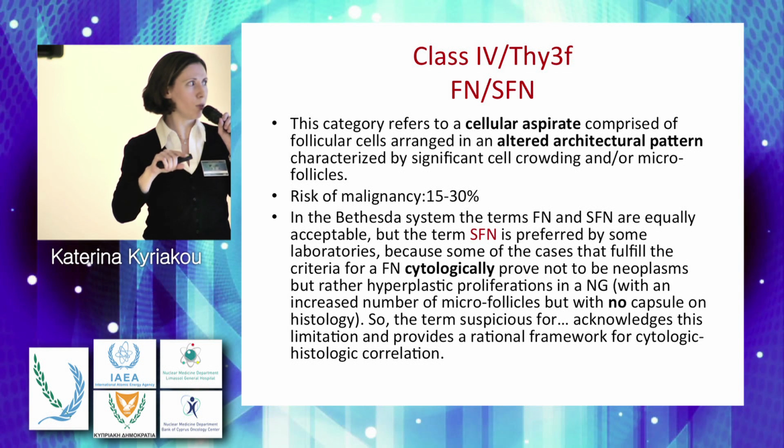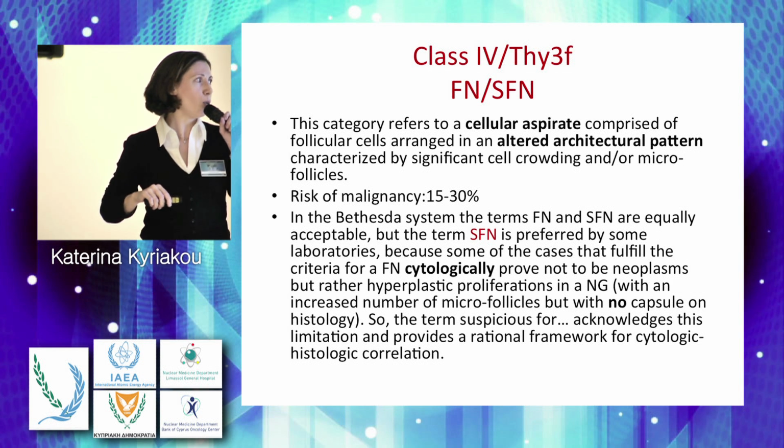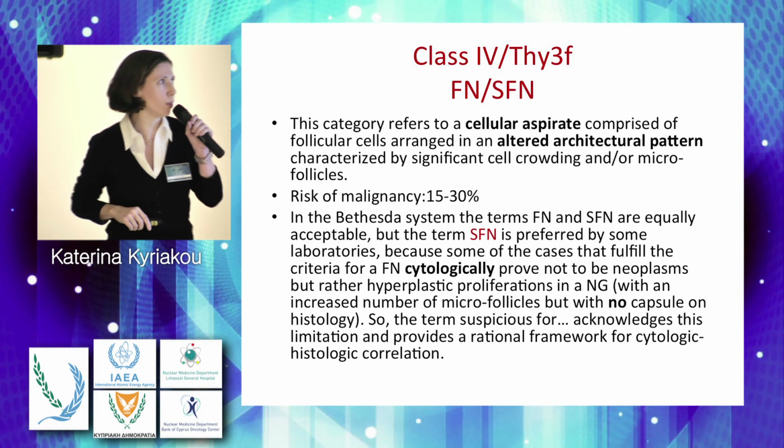They don't have a surrounding capsule of the neoplasm, but they prove to be hyperplastic proliferations in a nodular goiter, where we have an increased number of microfollicles but no capsule. So the term suspicious is better and provides a rational framework for cytologic-histologic correlation.